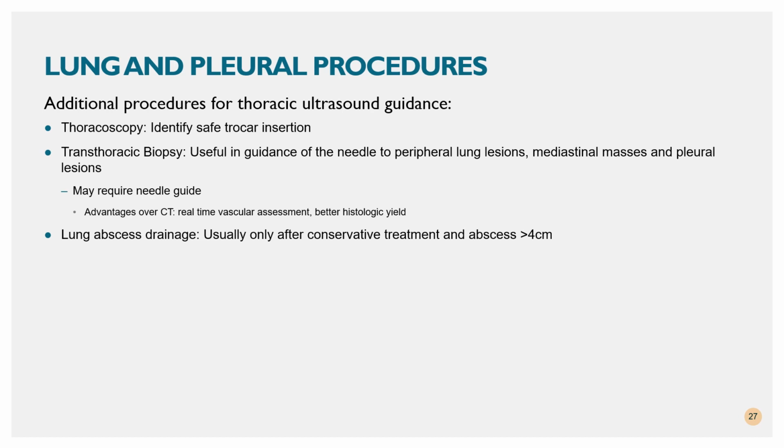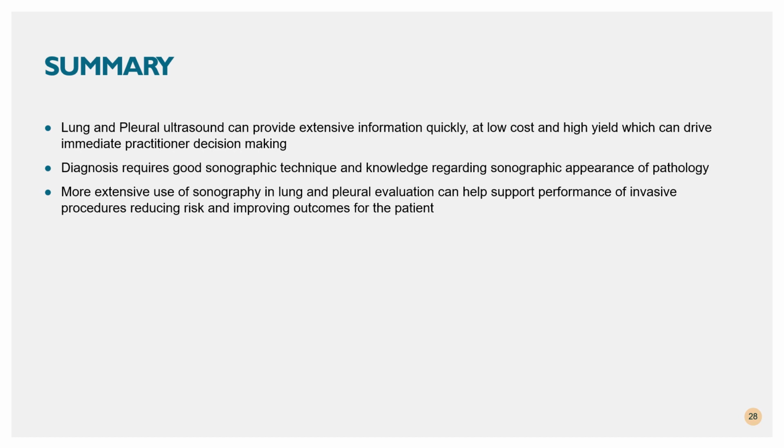So in summary, lung and pleural ultrasound can provide extensive information quickly, at low cost and high yield, which can drive immediate practitioner decision making. Diagnosis requires good sonographic technique and knowledge regarding sonographic appearances of pathology, as well as a good understanding of sonographic physics and instrumentation. Most extensive use of sonography in lung and pleural evaluation can help support performance of invasive procedures, reducing the risk and improving outcomes for the patient.